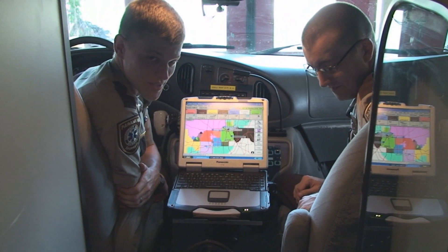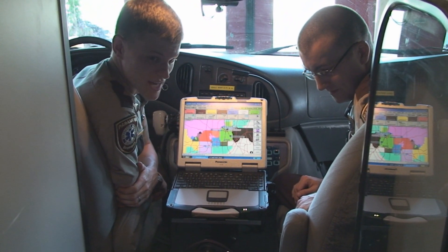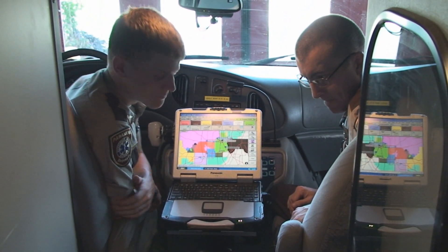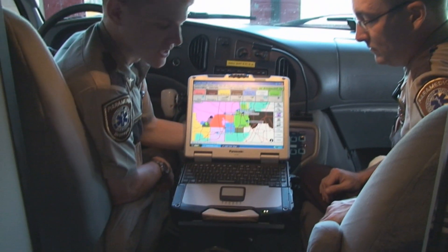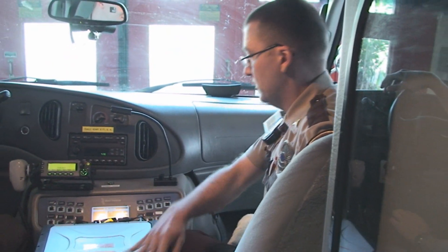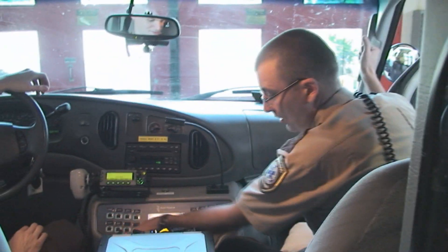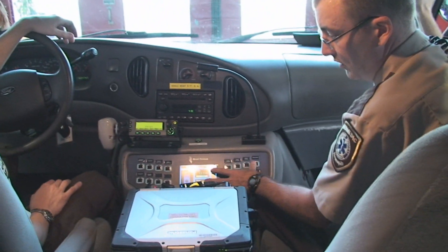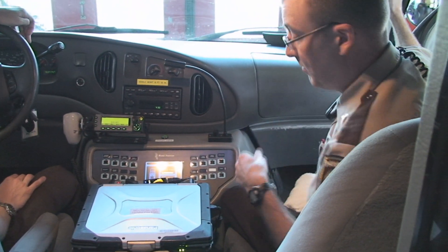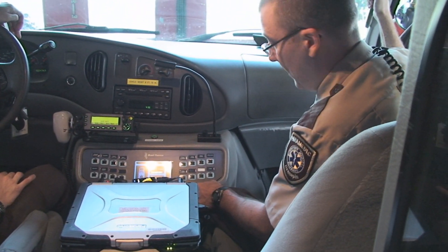In the front of our ambulance we have a lot of different equipment that we use to help us navigate and make sure that we arrive at the scene of an emergency safely. This device here is our MDC, which we use to get information regarding our calls. Up here we have our panel for our ambulance, which controls all of our emergency lights on the exterior of the vehicle, as well as electronics and lighting in the back of the ambulance.